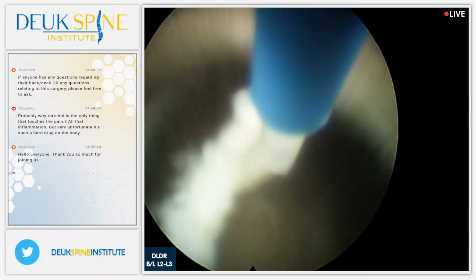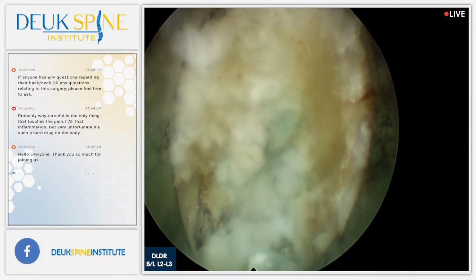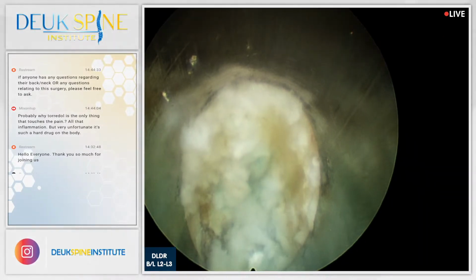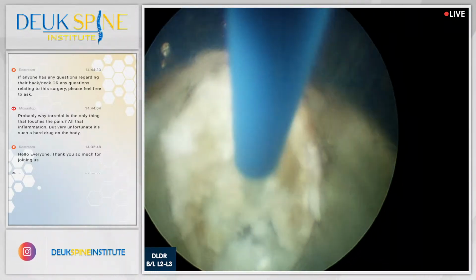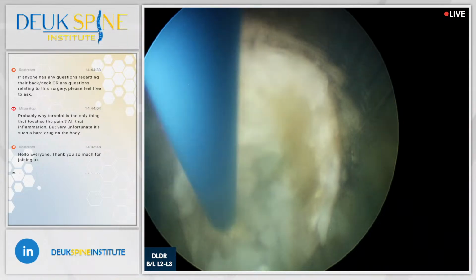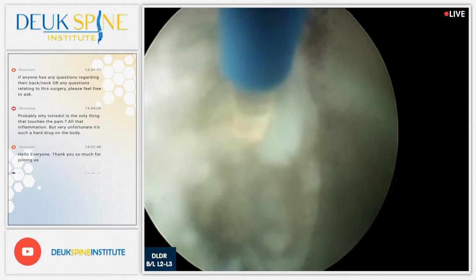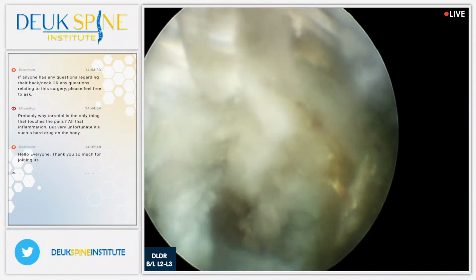It's working better, yeah. Everything okay, guys? Dr. Davis?